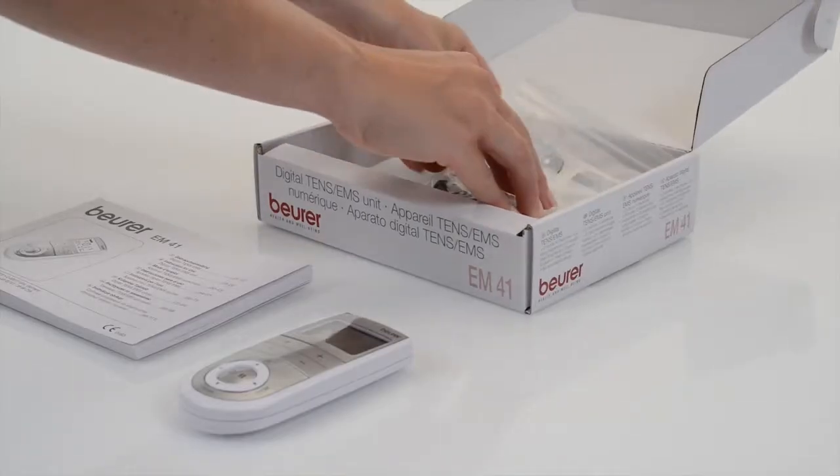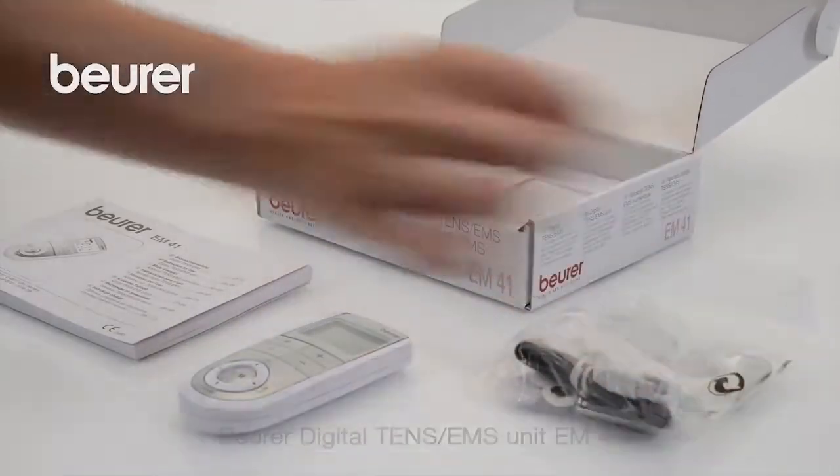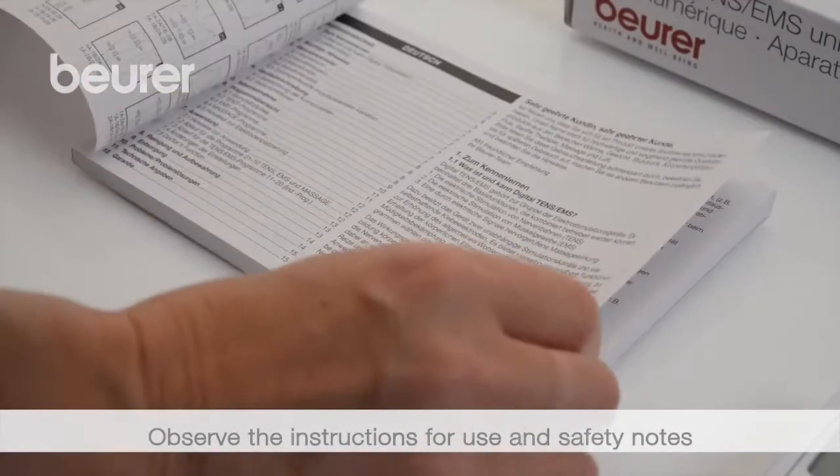This is a guide to the correct usage of the EM41. Pay attention to the instructions for use and safety notes.